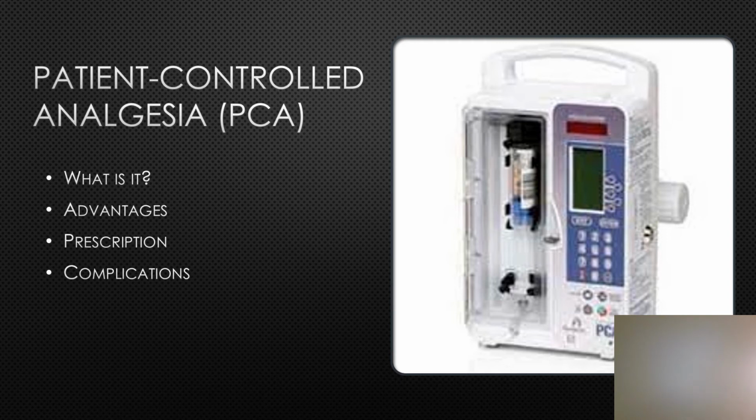It's used most often in postoperative clients or clients that have chronic diseases. And these clients must meet requirements. They have severe, constant, or intermittent pain. They have the ability to understand and comply with instructions, the ability to press the button, and they should not be sedated from other medications.